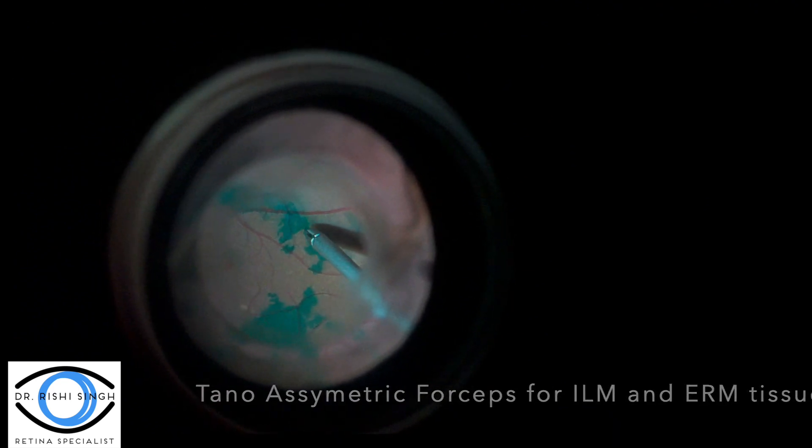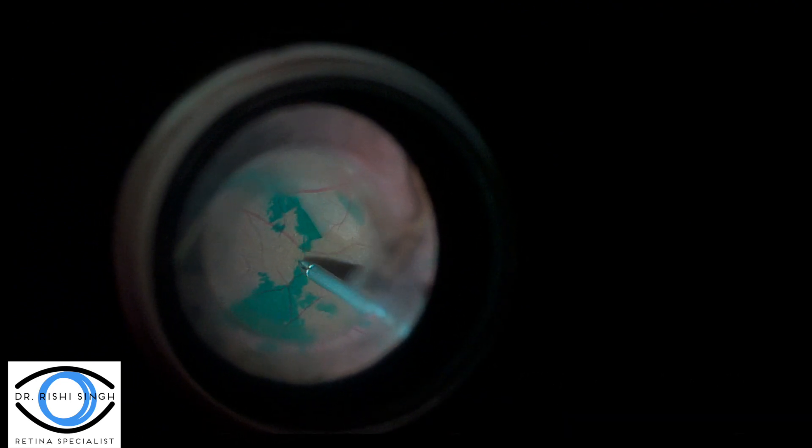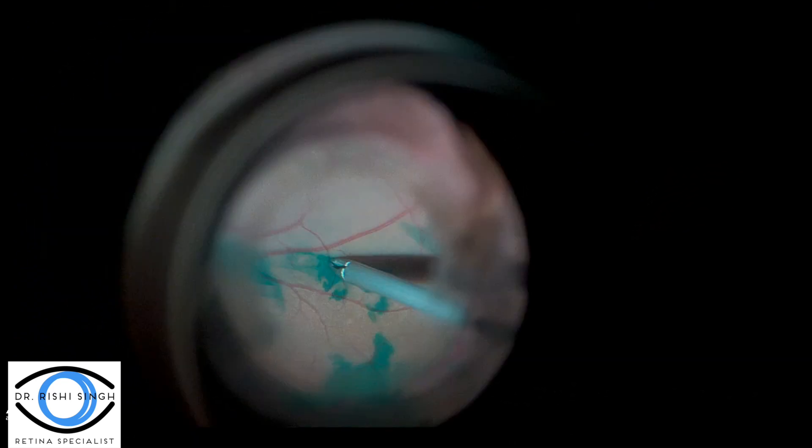Once the tissue is elevated, a temporal asymmetrical forceps is used to elevate both the ILM and ERM tissue together, and it is brought up to the hole edge. Care is taken to really go to the edges of the flap to elevate and get a large purchase area, rather than pulling from the center and avulsing the tissue from the macular hole.